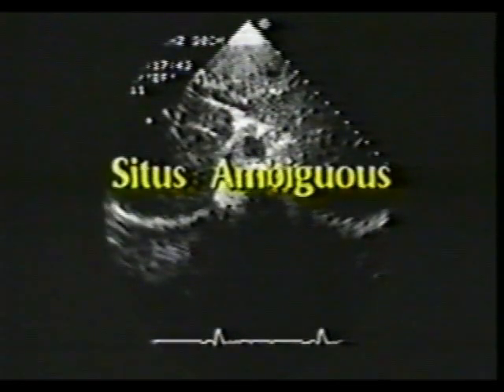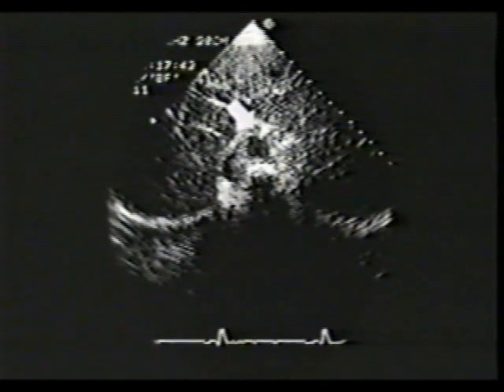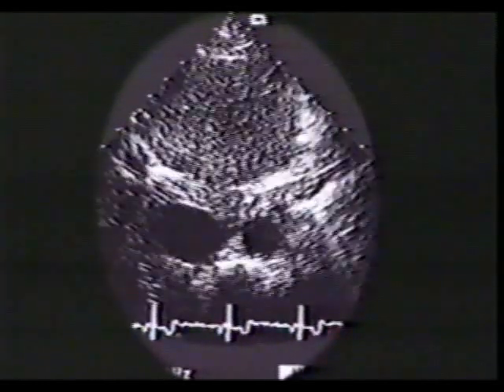In this example of a 22-year-old female with situs ambiguous and dextrocardia, note liver is in the midline with bilateral extensions. Aorta is also in the midline. Here is inferior vena cava, which is quite posteriorly located. Stomach can be readily identified because its contents are highly refractile due to admixture with air. This is well illustrated in this real-time example.